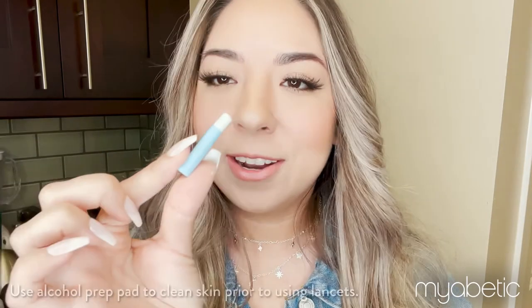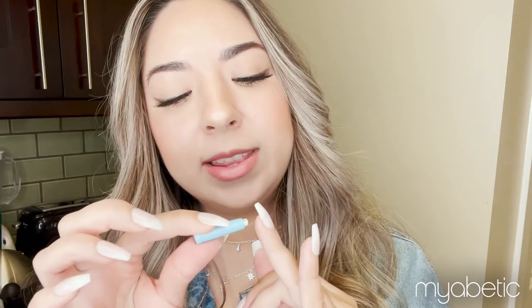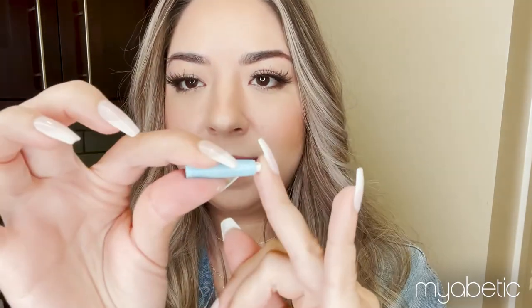Let me show you how it works. Here's the lancet, and first, you twist the cap in a full circle to remove, then you push gently on your test site, and you discard the used lancet in an appropriate container.